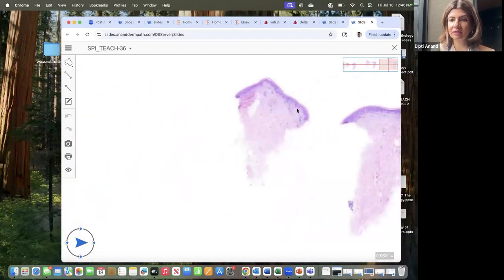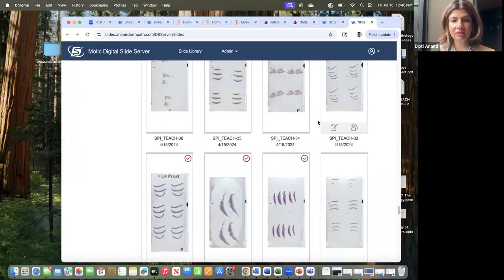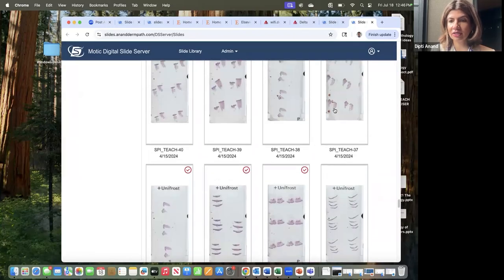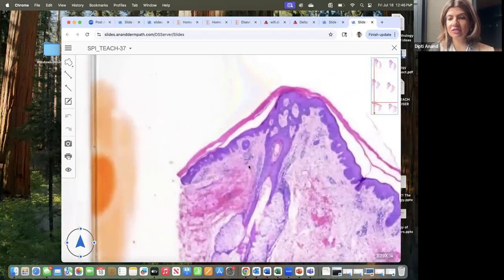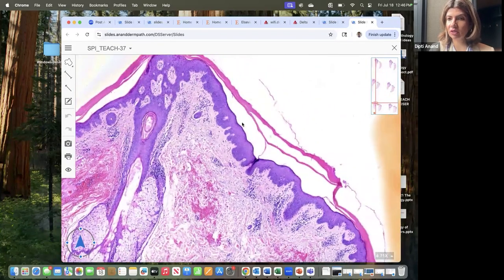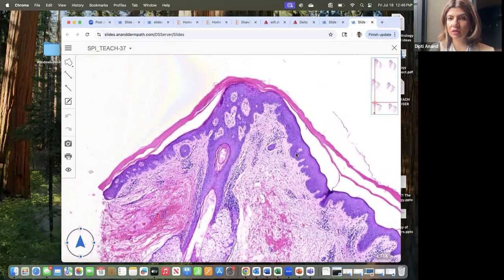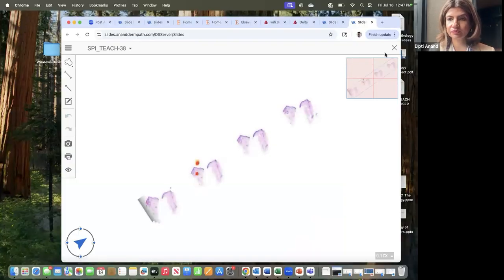Do we see a plugged follicle here? We do not see one in here, but this is the corresponding other piece of it. This is the follicular plugging. So you can see the plugged follicle with parafollicular parakeratosis in a bright pink cornified layer. Okay, so that's PRP.